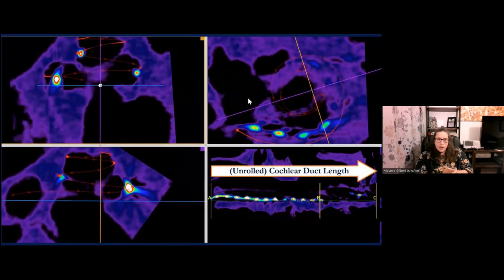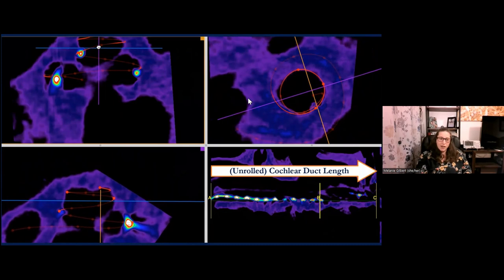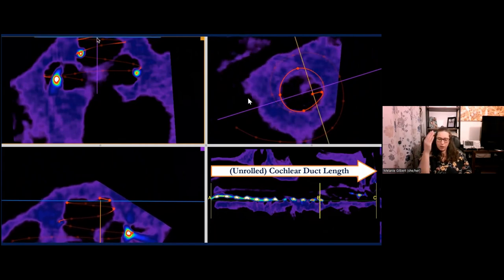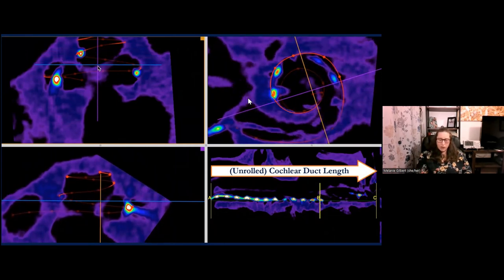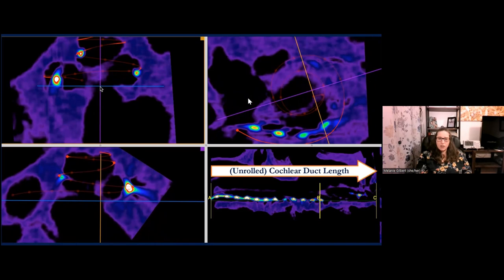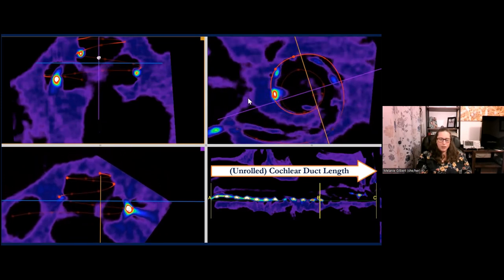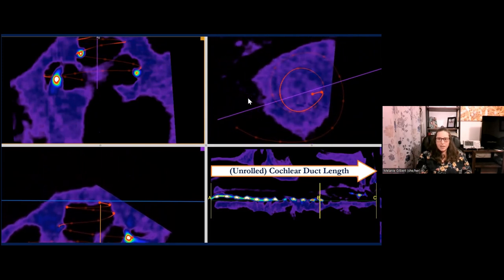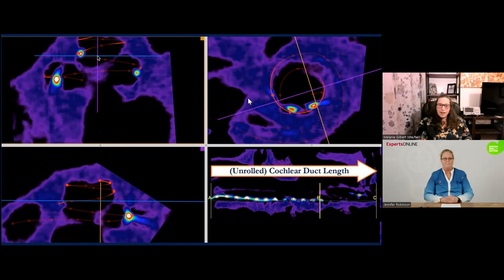This is a video that I created that shows scanning through the cochlea on one of these high resolution CT scans. On the left two panels, you'll see a cochlea that has been cut down the middle. And on the top right is the spiral view, or the looking down view. As we drag up and down through the cochlea, you can see the electrodes appear and disappear. There's a red line throughout, following the lateral wall of the cochlea. If you unroll that red line on the bottom right panel, from A to C, you see the cochlear duct length. This is one way to measure total cochlear duct length and the location of each electrode, and then calculate the characteristic frequency.